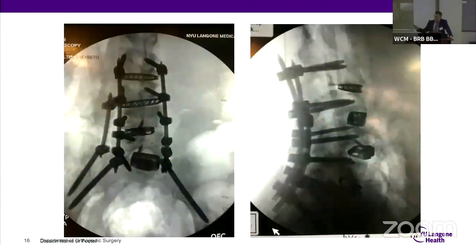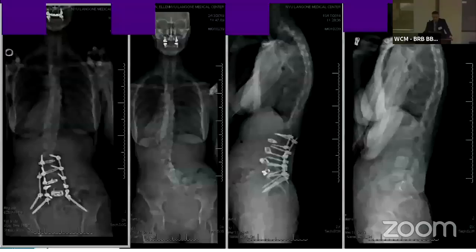In this particular case, I used a kickstand as well to push the spine over after I locked in a short rod to maintain the fractional curve lordosis, techniques that I've learned doing open surgery. It does require a little mini open to get a distractor in. So that area where you see a double-headed tulip was a slight mini open area, but the rest of this case was done percutaneously. And the overall alignment's pretty good. She's got a leg length discrepancy, which explains why she's got that residual curve above it. But I think with a shoe lift, that'll balance out, and she's much better corrected.